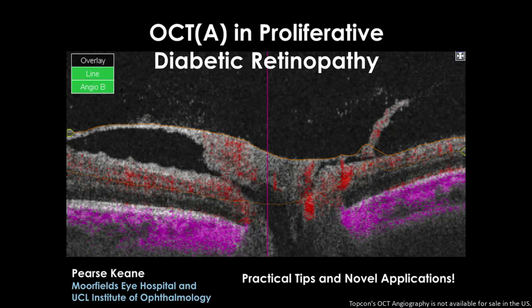And number two, my prediction is that 2 or 3 years from now, everybody is going to be using OCT and OCTA in the monitoring of the treatment of our patients with proliferative diabetic retinopathy. And in fact, across all the patients with diabetic retinopathy.